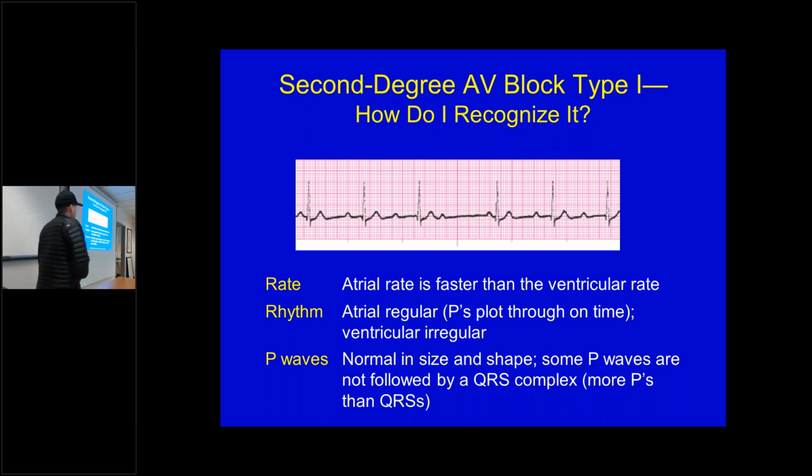No, they're not working independently because the bottom is not firing by itself. The QRS is always firing with a P wave or after a P wave. It's just that in this circumstance, the P wave's still there, but the QRS doesn't fire. If a QRS is going to fire, it's still going to fire after a P wave or because of the signal coming down from the atrium.